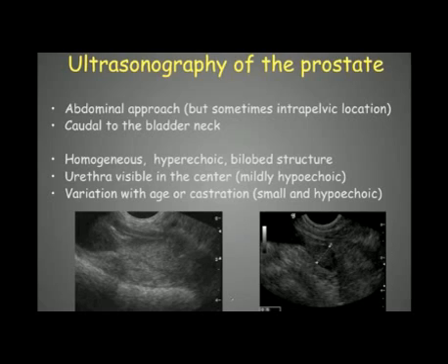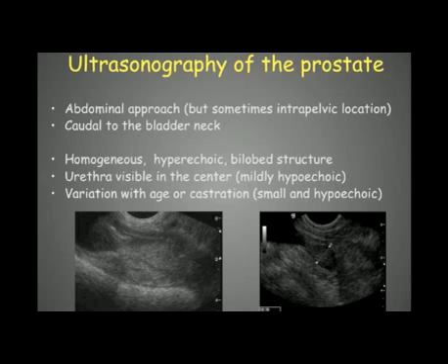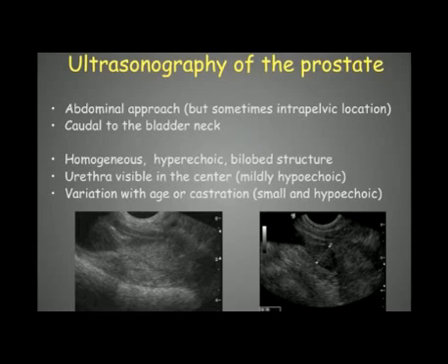To locate the prostate we usually use an abdominal approach. Sometimes the prostate is located in the pelvic canal, making it difficult to reach. The prostate is located caudal to the bladder — we follow the bladder neck and generally arrive directly on the prostate.